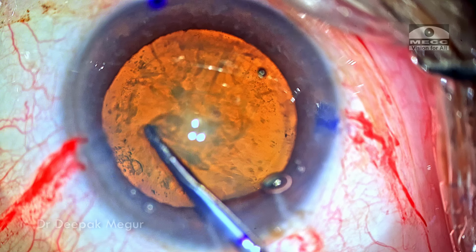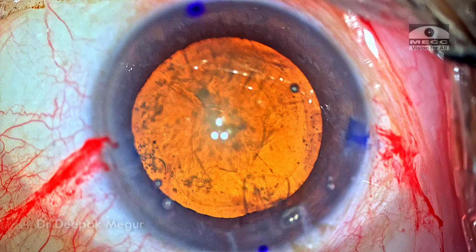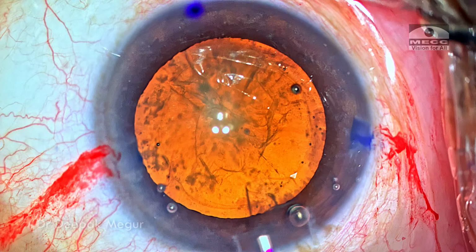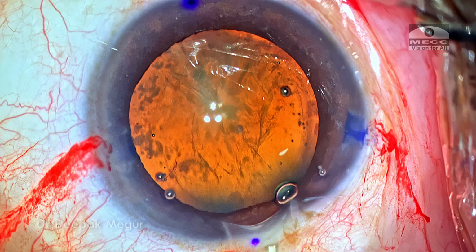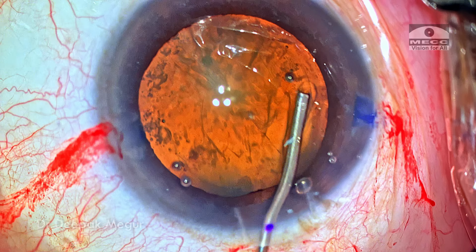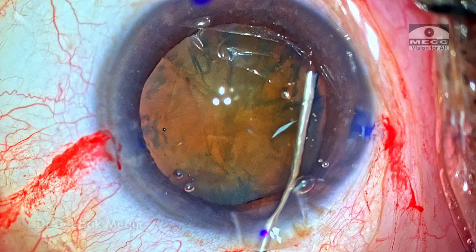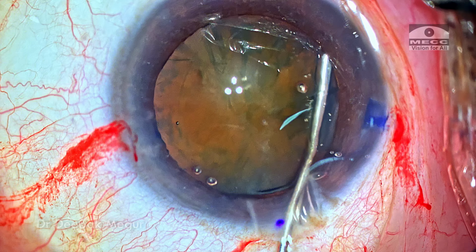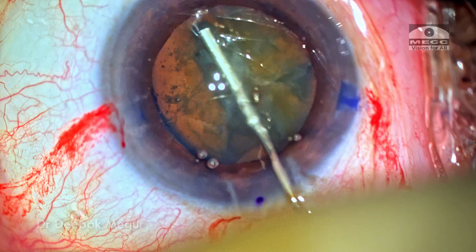I just want to be a little bit slow and careful just to ensure that I get the appropriate size. It looks alright and adequately sized. Time to perform hydrodissection. Now, since I was pretty sure that there did not seem to be any evidence of pre-existing posterior tear, I'm going ahead with doing hydrodissection. I just burp out the OVD first, and gently, using very little amount of fluid, I'm doing a hydrodissection, and then I'm just trying to tap the lens and to let out the fluid which is there.